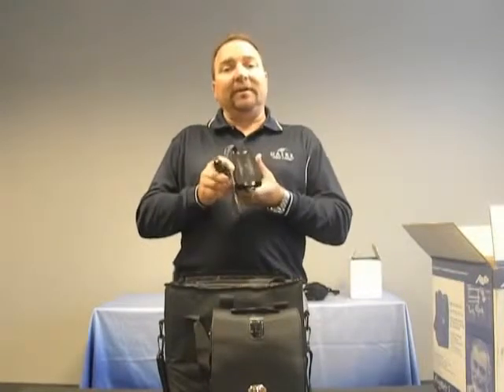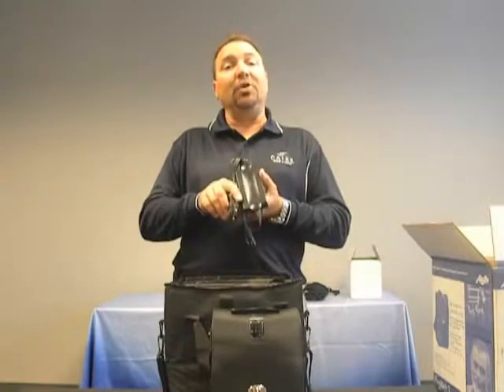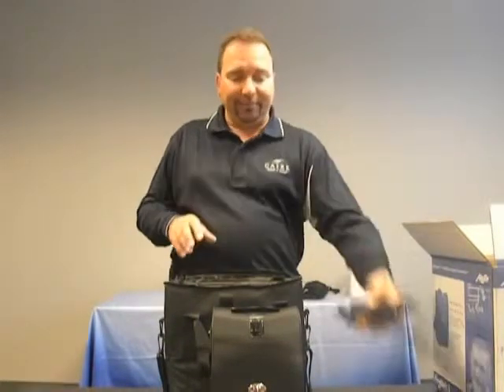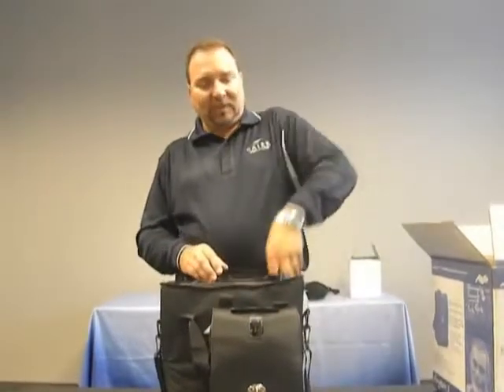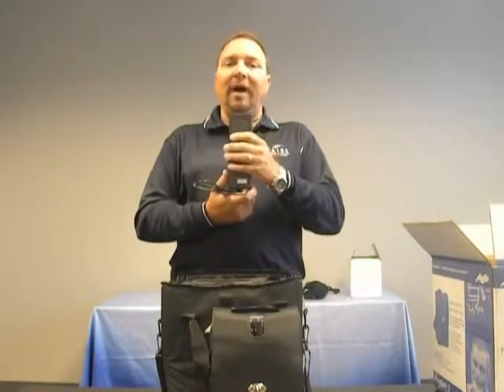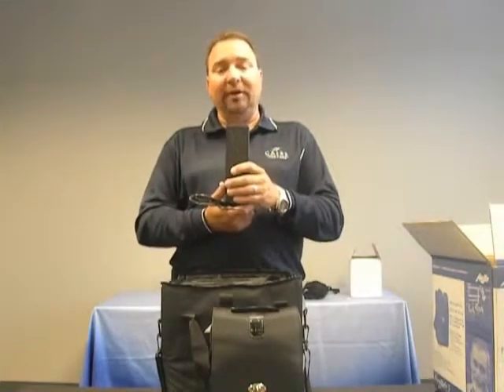In addition, you will find a DC adapter. The DC adapter allows you to use the FreeStyle 5 in your automobile using the accessory or cigarette lighter. In addition, there is an AC power supply. The AC power supply will provide AC or electrical current directly to your FreeStyle, powering the device on electrical current.